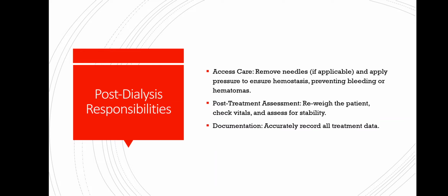Next, let's discuss post-dialysis responsibilities. First one, access care, then post-treatment assessment and documentation. Access care means removing the needle if applicable and applying pressure to ensure hemostasis and prevent bleeding or hematomas. Then post-treatment assessment: reweigh the patient, check vitals and assess for stability. Documentation: accurately record all the treatment data.